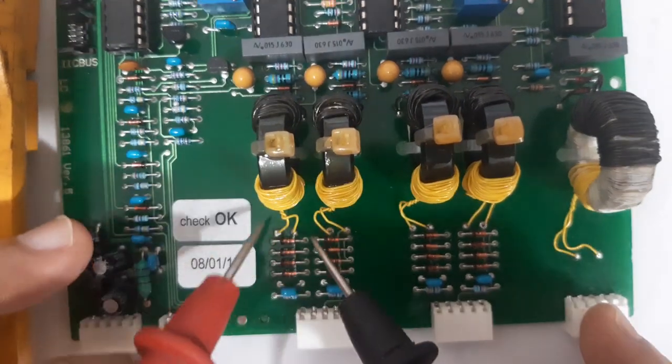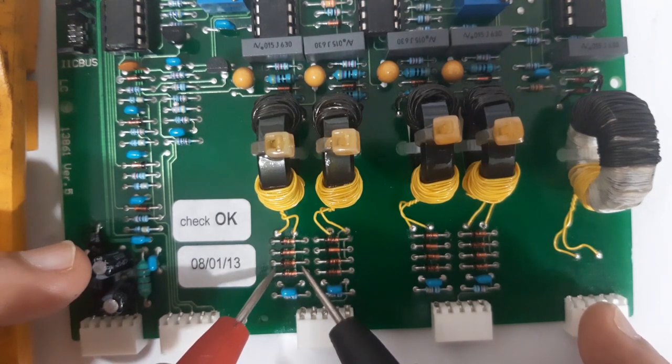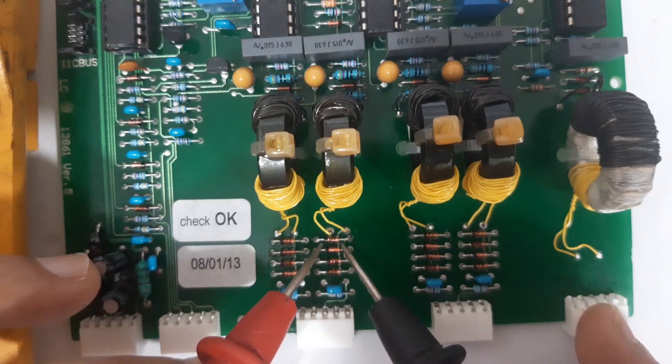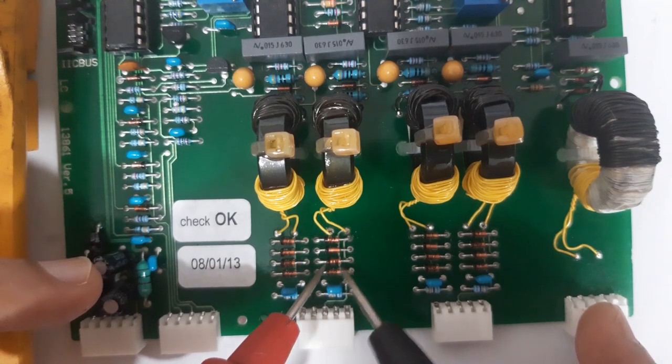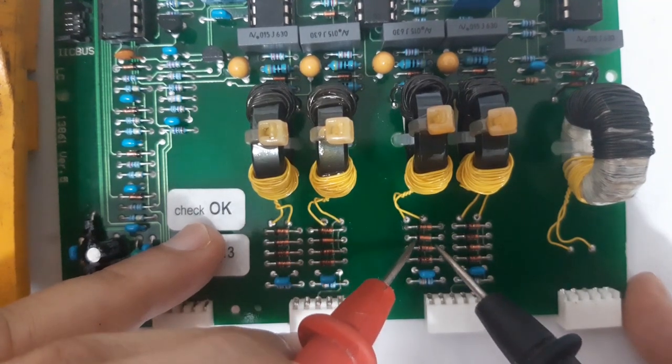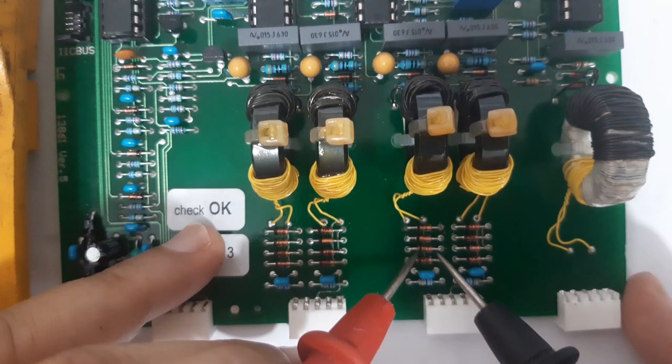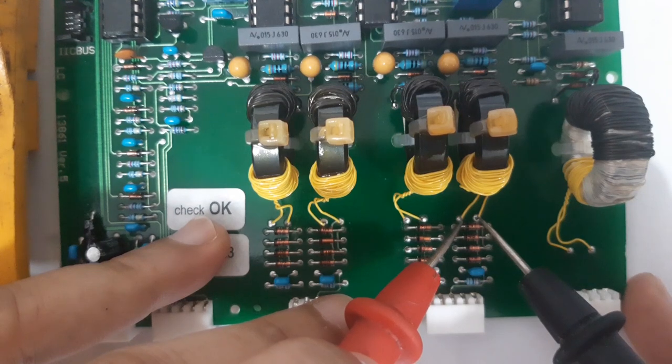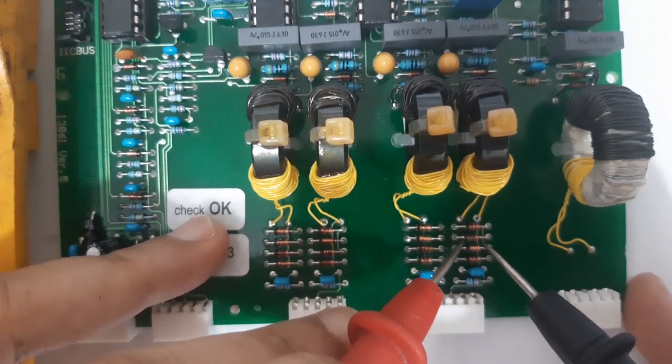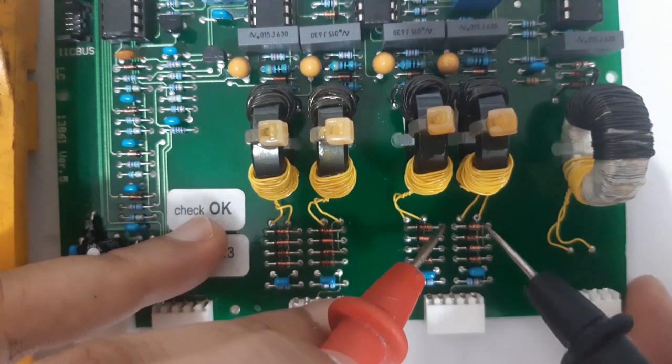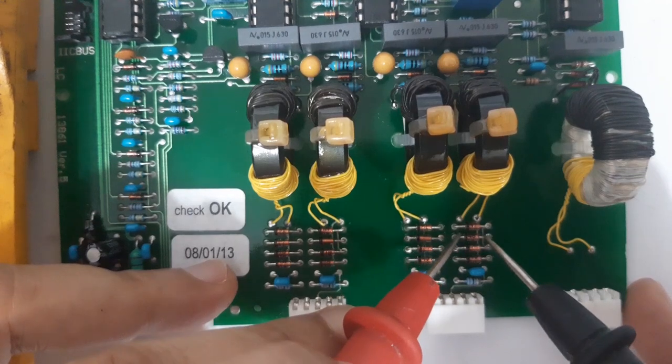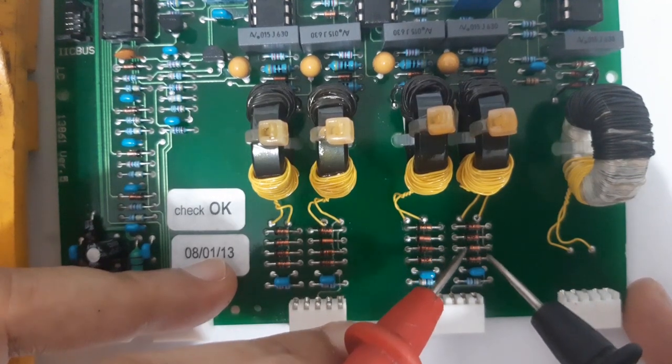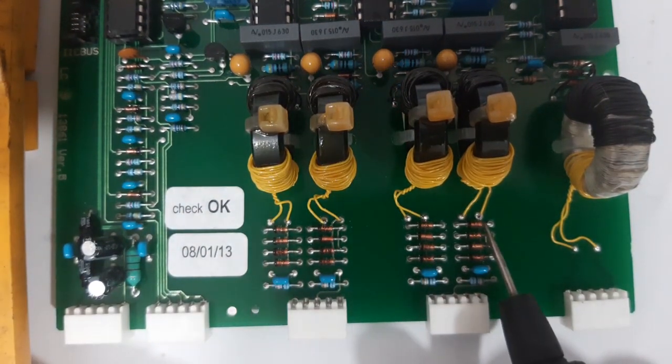We will check it like this. I see some value on the multimeter but it's okay. Once I hear the beep it means there is a short. That is the only thing I want to know now. So you see, these four zener diodes are reading short.